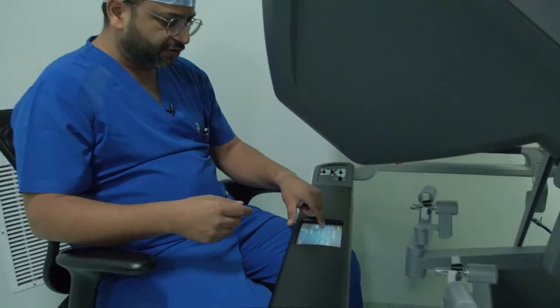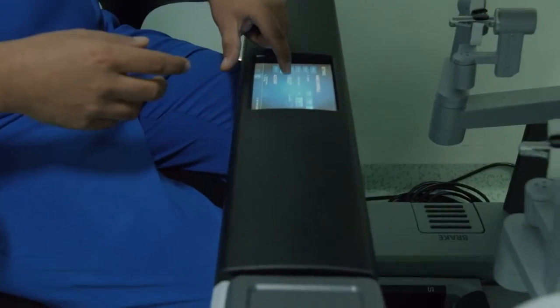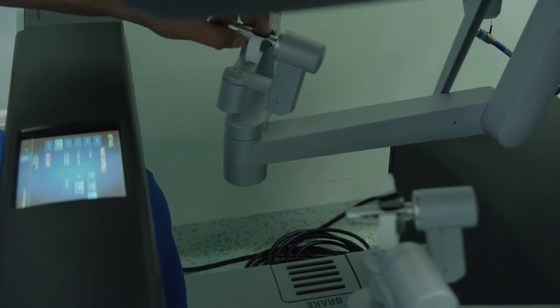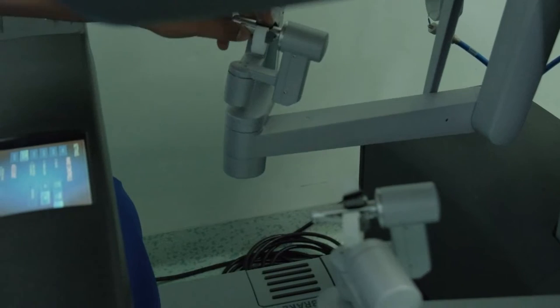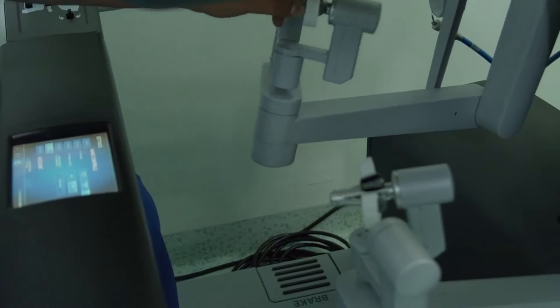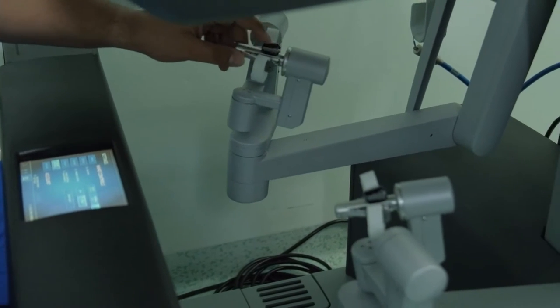The finger clutch can be switched off and on. So these are the finger clutches. These finger clutches allow the master controllers or the hand controls to move without moving the instrument tips. So we just press this button a bit and it allows the hand controls to move around.